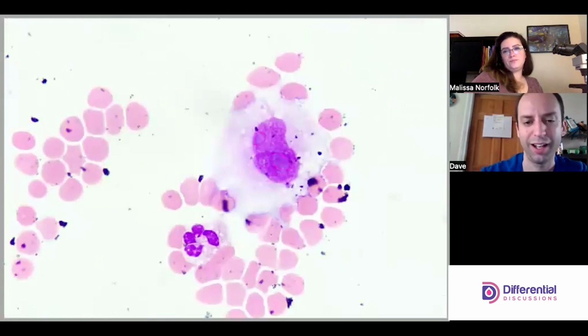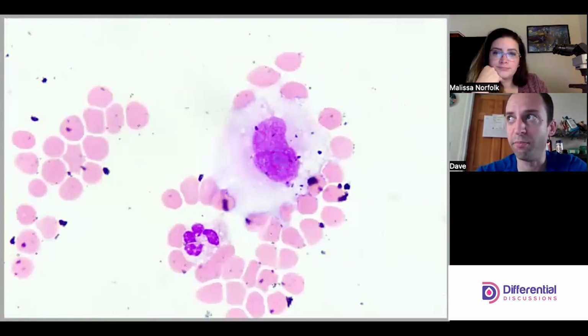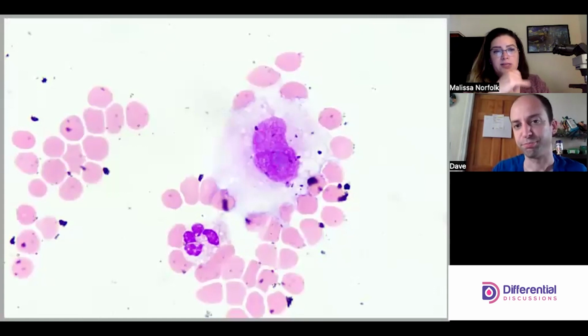But there's a switch that flips in my mind, and I'm not saying that this is best practice, but when I've confirmed that there's possible malignancy going on, cells then have to prove to me that they're a normal cell. I agree, because given the company this cell keeps with that ugly dark staining area and the nucleoli, it almost looks like it's bilobed.